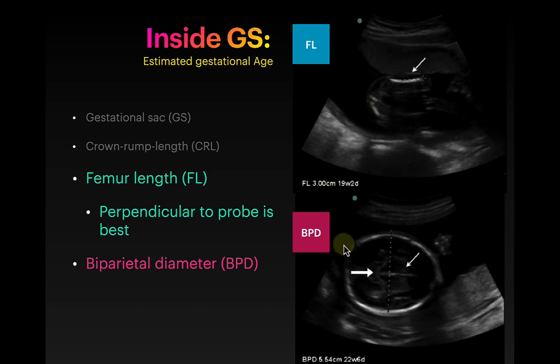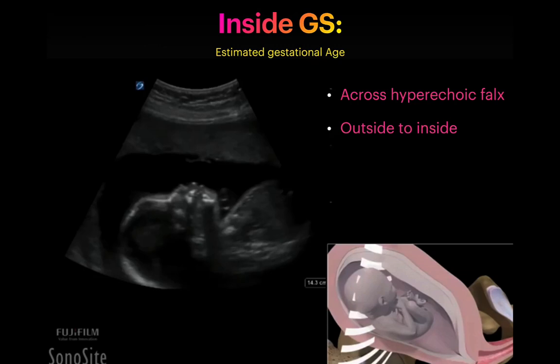And then the other one that I'll most commonly see, because if a patient comes in late pregnancy, we want to know where that head is anyways. So it's not unusual for people to do biparietal diameter, because we are trying to get right up to that head to find out if it's in the pelvis, or if it's not.